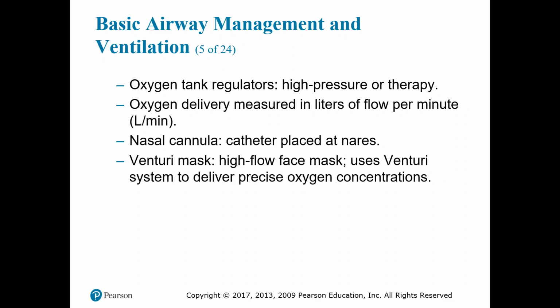You must continually reassess the patient who requires oxygen therapy to be certain that the method of delivery and flow rate are adequate. So if you throw a patient on 2 liters per nasal cannula and you started out at 88% SaO2, and that only bumps up from 88 to 90 on 2 liters, you may need to either bump that up to 4 or 6, or you may need to switch to a simple face mask, but you need to judge your patient and give that opportunity to work. But that falls back on your reassessment skills or your reassessment routine.